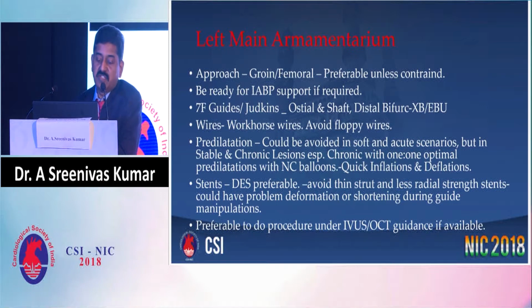Wiring, whichever workhorse wires you're comfortable with, you can use. Generally we tend to avoid floppy wires. Pre-dilatation is again very important. As usual, anywhere, the bed has to be prepared well so that stents expand well. And then there's no discussion.